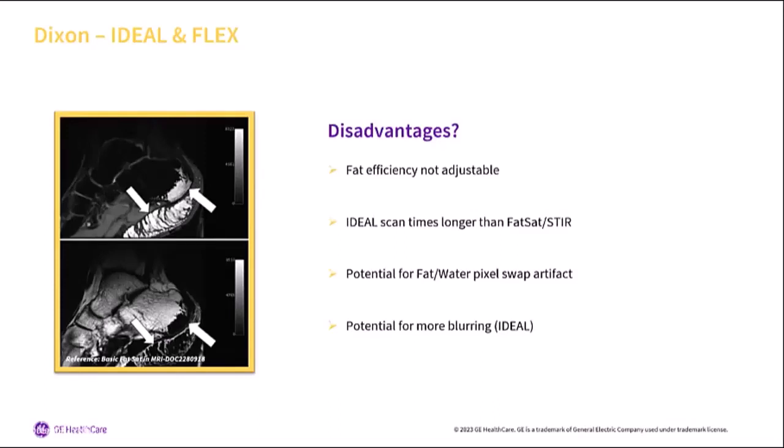However, there are a few things that we can do to try and minimize that misregistration between fat and water. So one of the things is to ensure there's no wrap in the image. So ensure our field of view covers the whole anatomy, or that we use no phase wrap accordingly. We should also avoid air tissue interface changes or just adapt our field of view very well to our anatomy.